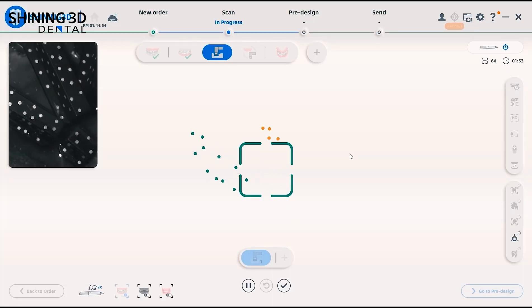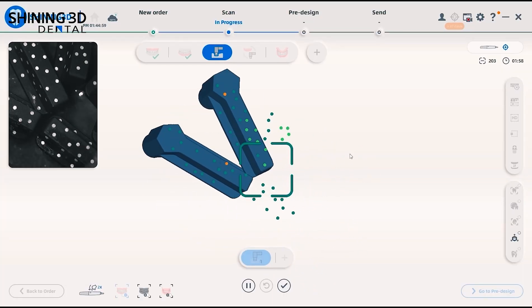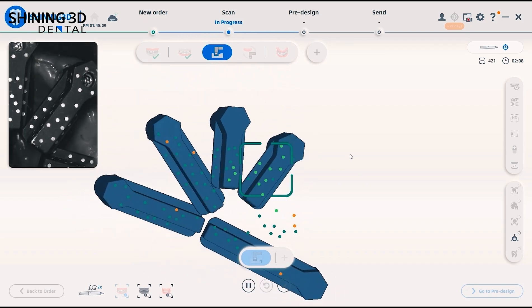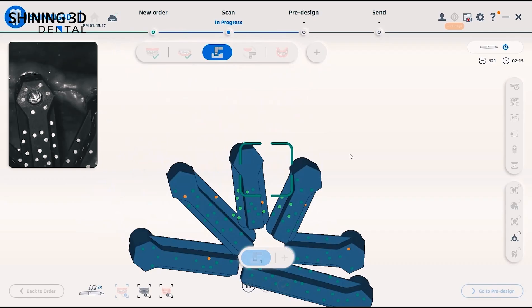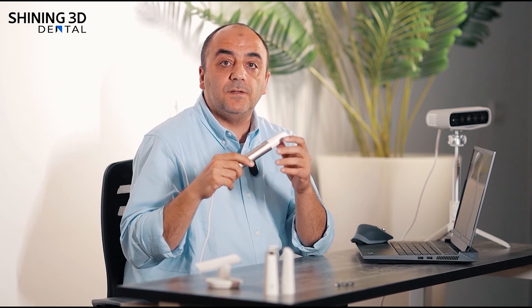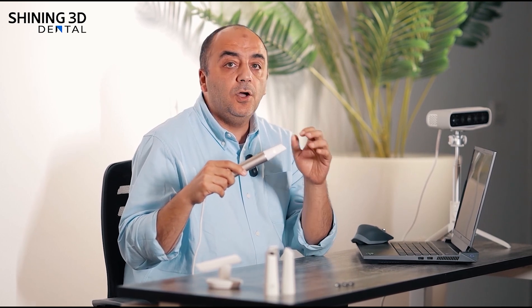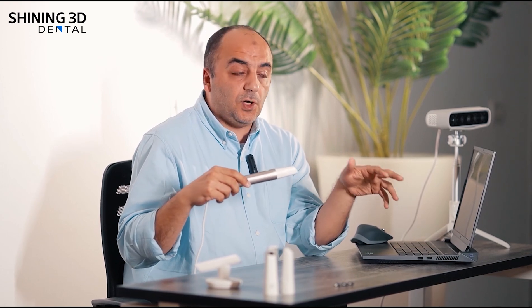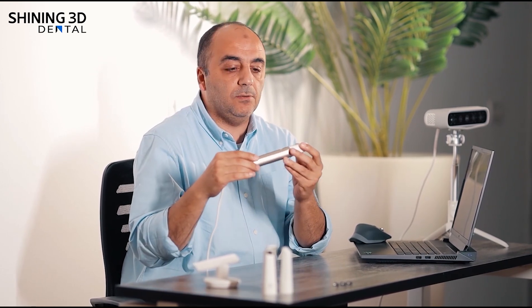When I go to the photogrammetry option, it starts scanning the special scan bodies called the scan pegs or scan picks. Those scan picks, when scanned, are captured with the photogrammetry technique and not the structured light technique. This helps us to get a very accurate scan for the implants in full-arch cases, because it's not only a structured light scanner like ordinary scanners — it also offers a photogrammetry option.